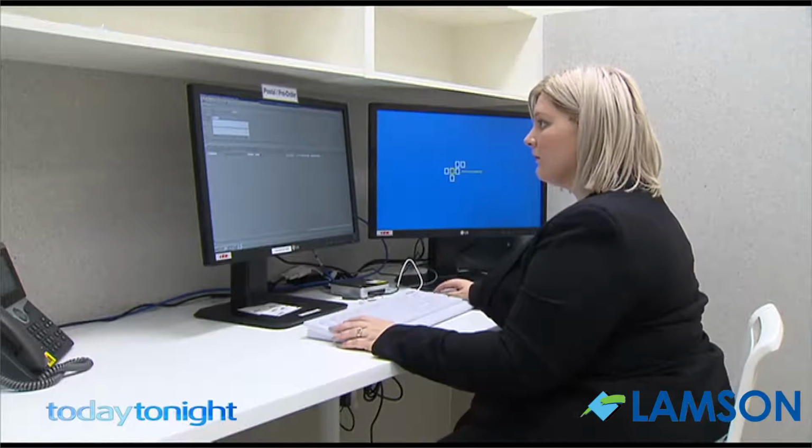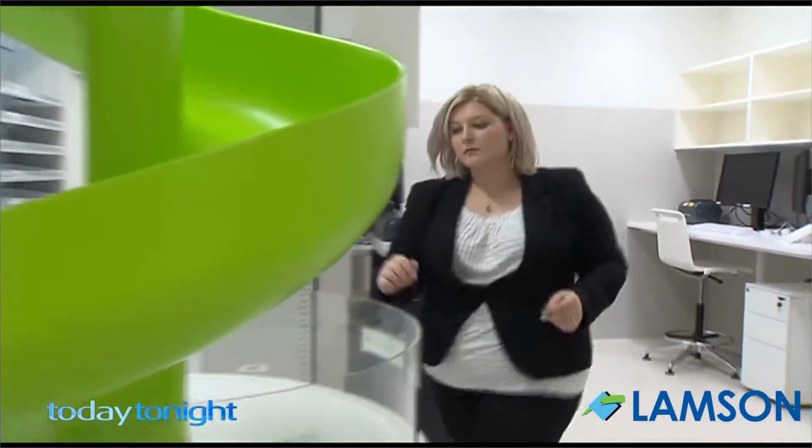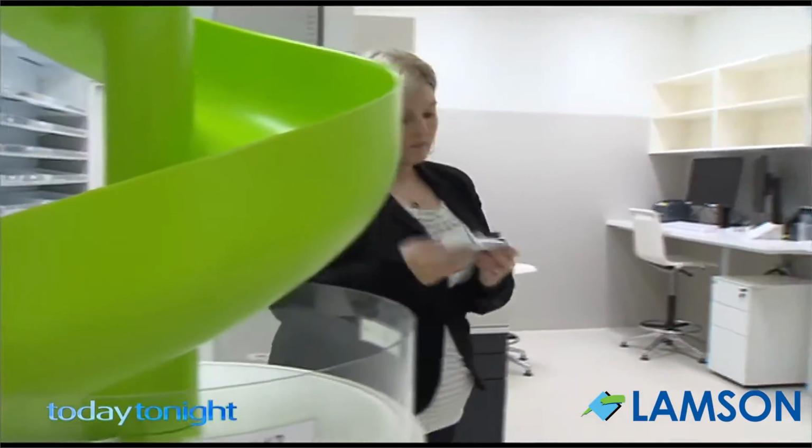Jazz Hosking is in charge of the technical side of the operation. She says the system, which has been used extensively overseas, has been shown to significantly reduce dangerous mistakes. We remove a lot of the risk of selecting the wrong medication, which is quite a significant risk in hospitals, particularly those with big long drug names. They all sound the same, they all look the same. So by being taken to a particular drug with the flashing light, and there's also alerts if they access the wrong one accidentally.